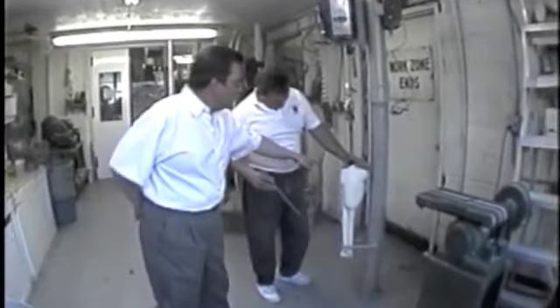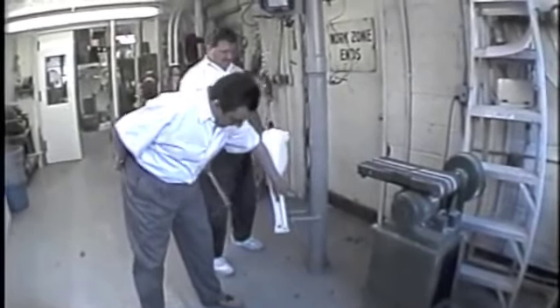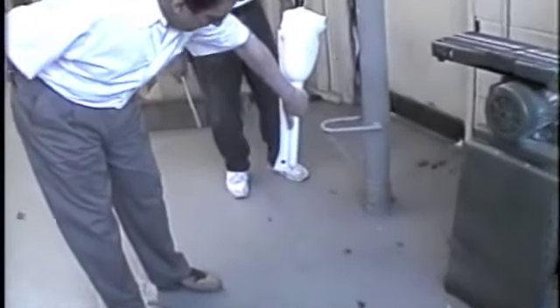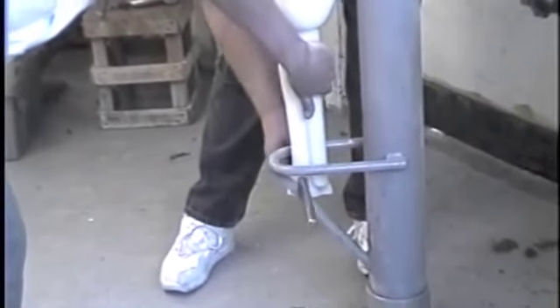Okay, now we've removed the waste from the top of the model. We've drilled a 3/4 inch hole in the fleshiest portion of the plastic down there, because remember, this is going to take 2,000 to 3,000 pounds of force to extract. So you want it really tough down there. Put it through this clevis, and that's it.